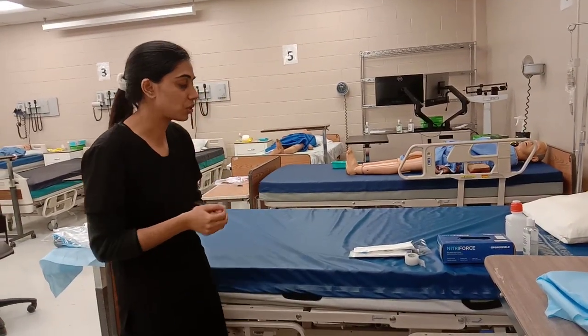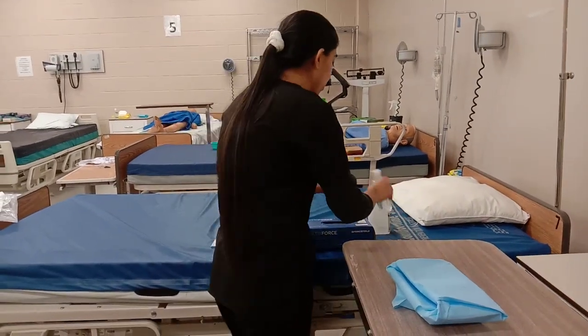My name is Sukhpreet Kaur. My student ID is 1649692114 and today I am going to perform the procedure of sterile wound dressing. So firstly, checking the doctor's order, performing hand hygiene.